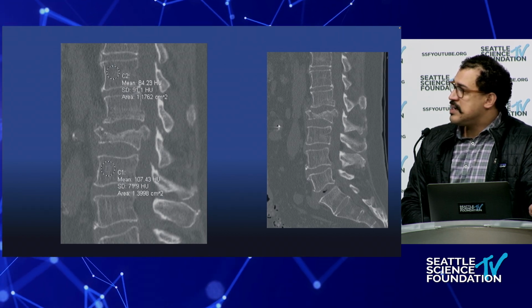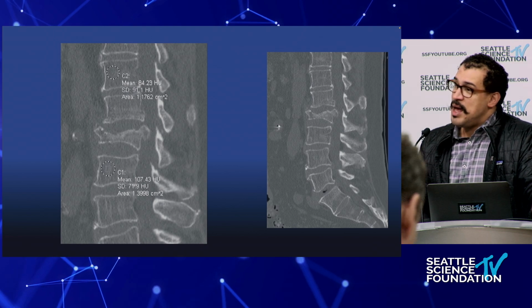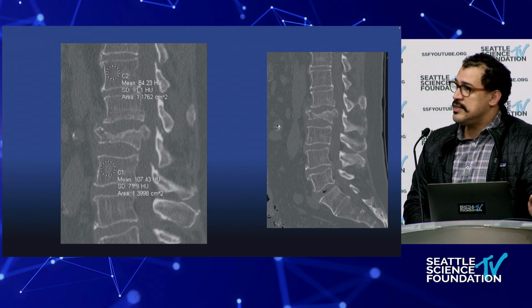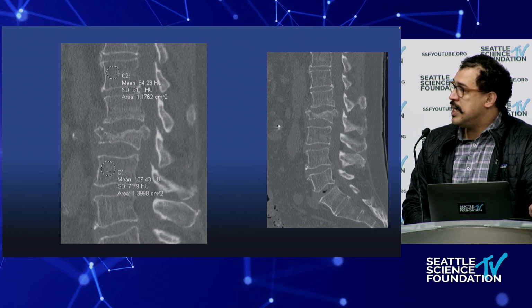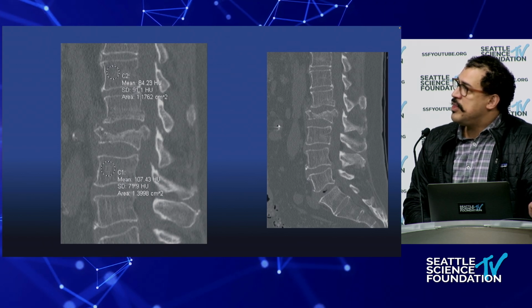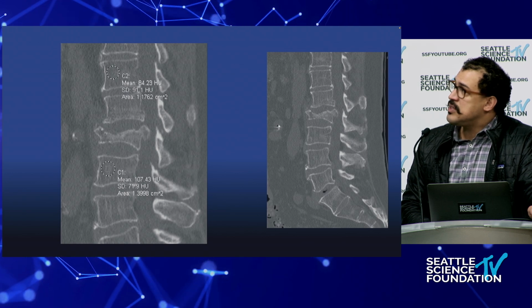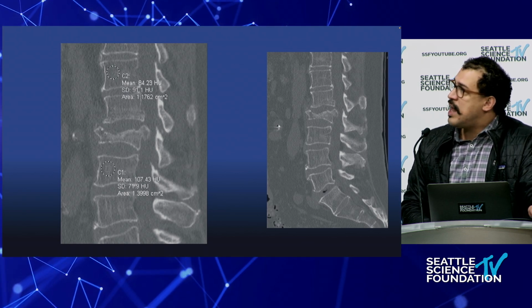Going back to that patient, these are 80 to 100, not that bad. Often we'll see numbers in the 40s, where I think it's absolutely necessary to use some cement augmentation. But again, I think history alone, you can use it. This is the quicker way to do it, but technically it's an axial slice through 3 slices of the vertebral body to give you that average number.